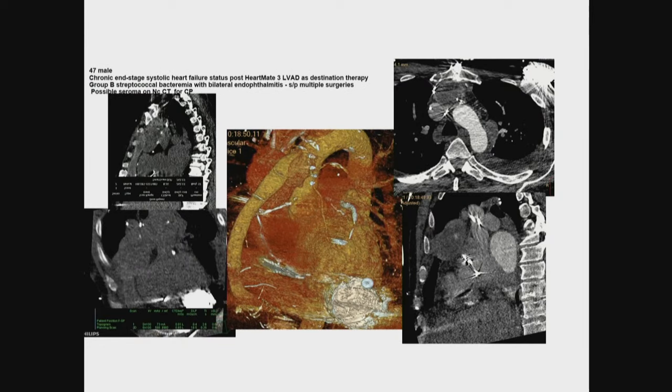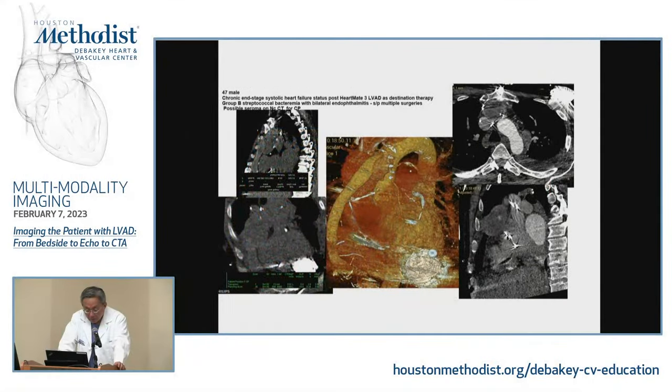In this case, I think also is one of the most dramatic cases we've seen. It's a patient with a history of endocarditis and infection in the eyes, who showed up with a mass in his sternum, and a regular CT showed a gigantic cystic-like structure located substernally and possibly connected to the cannula and ascending aorta. You can see right here. And this is the 3D reconstruction, so all these things here.